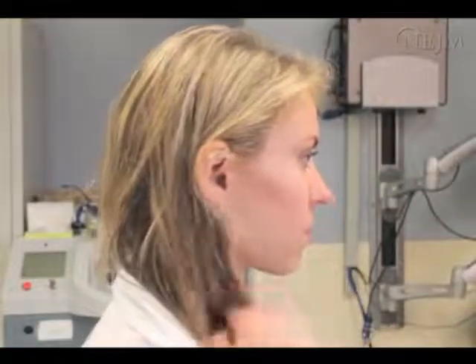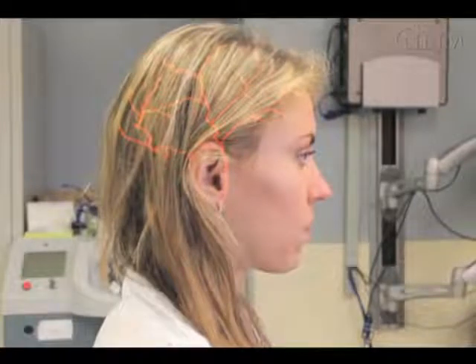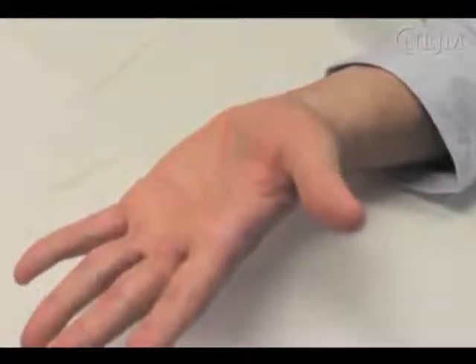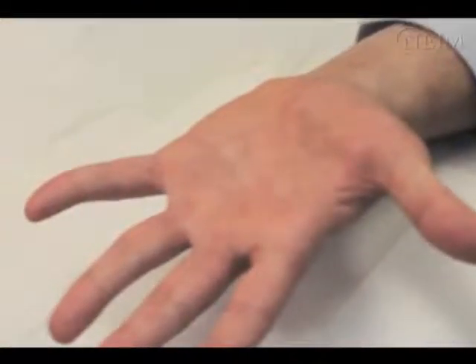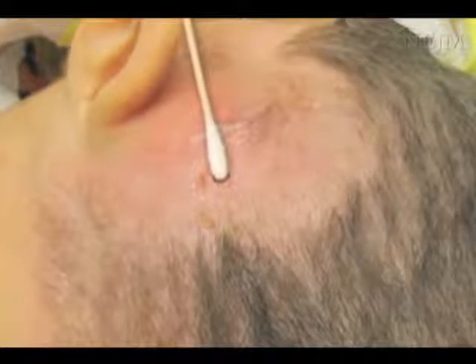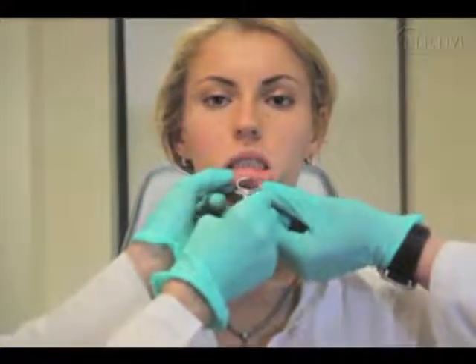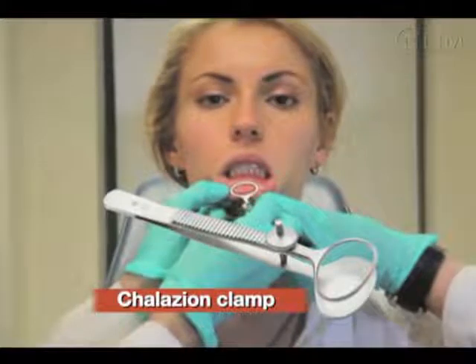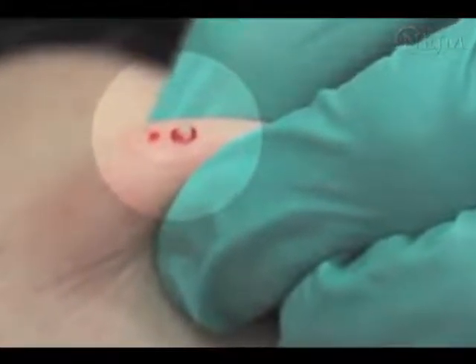Remember the anatomy when performing a punch biopsy to avoid damage to major blood vessels and nerves. Avoid punching medial and lateral digits, and palpate for the temporal artery before biopsying near the temple. When performing a punch biopsy on the palm, recall that there is very little subcutaneous fat, and once the entire dermis is breached, the instrument is essentially at the level of the fascia — so do not press hard on the punch. When taking a specimen from the highly vascular scalp, be prepared for brisk bleeding. When performing a biopsy on the lip, which is highly vascular and extremely pliable, use a chalazion clamp to allow for easy handling and intraoperative hemostasis. In infants, the subcutaneous fat will push the specimen up, making it relatively easy to grab, so you will not need to punch much beyond the dermis.